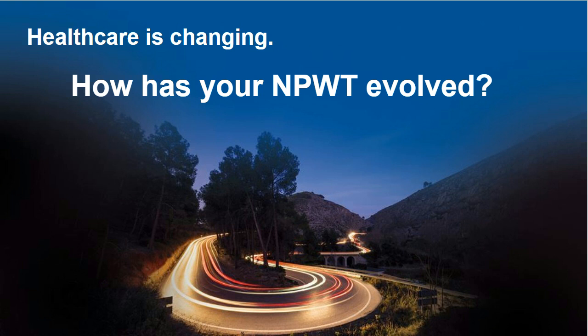From the perspective of does it make a difference and do we know, I don't specifically know. I know that for years, before we had a 125 millimeter setting on our devices, we were at minus 120, and we were always challenged or asked about it, because that difference was clinically concerning to many users. While I don't know, there might be clinicians, and Peg, it might be interesting to get your perspective, but I do know that for years people were uncomfortable with a system that only delivered 120 millimeters of mercury. Now we have one that delivers 125 and holds it, and actually stays within the spec range that has been defined.